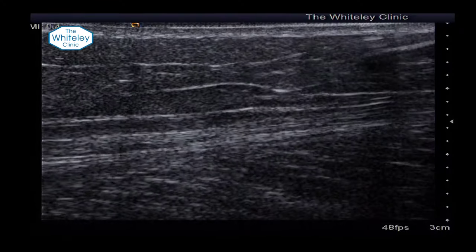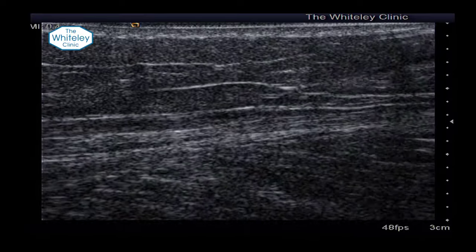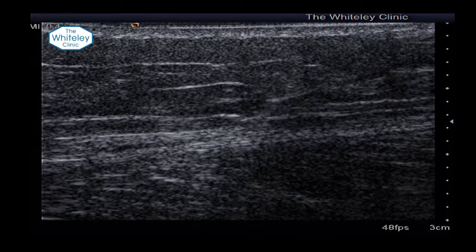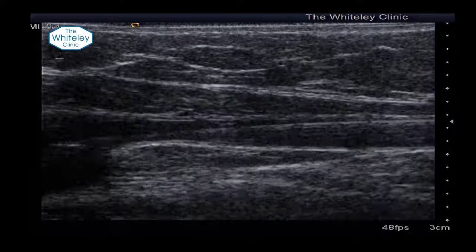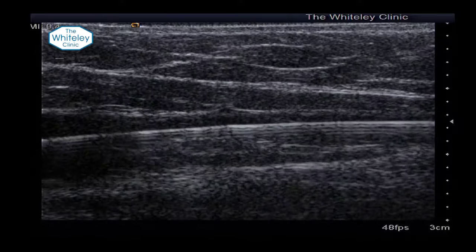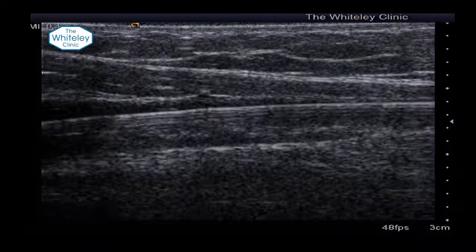You can see first of all we line up. You can still get into a spasmed vein — most of the time it's just obviously a smaller target. And we can see there on the ultrasound: in transverse section it looks like a little star, and in the longitudinal section you can see the actual wire going up.